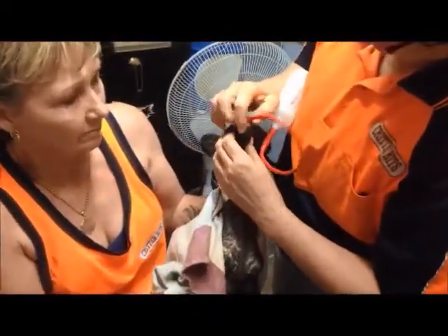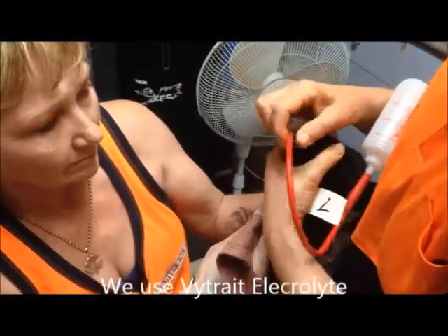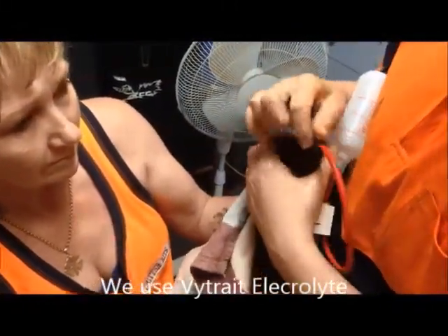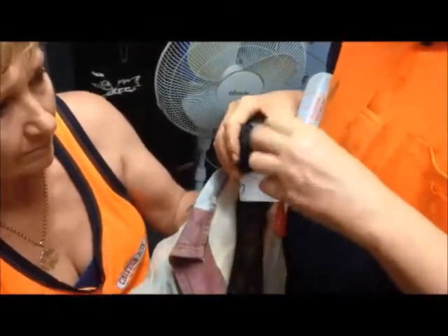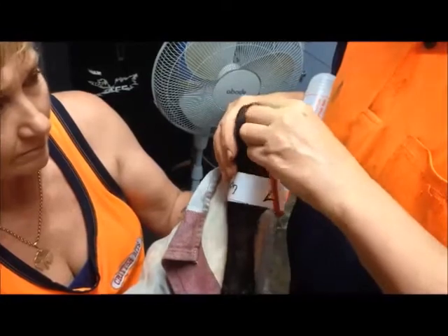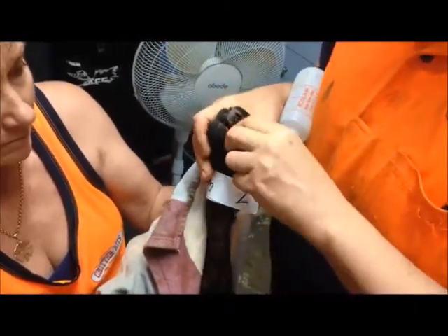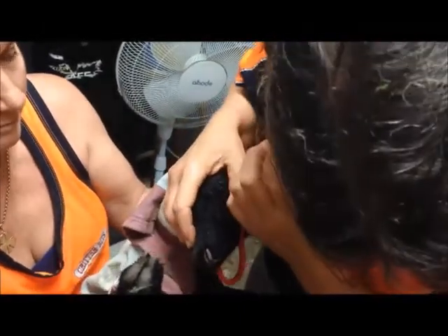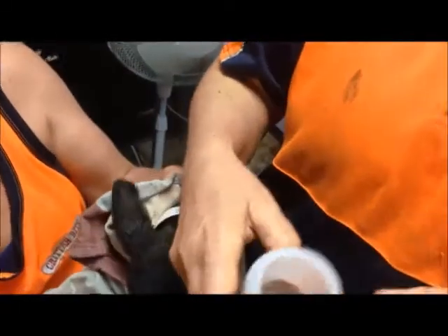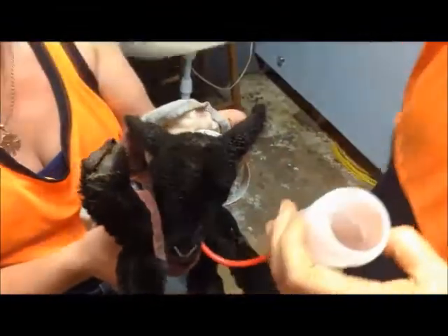You pop it down his little throat — they don't like this terribly much, but it sure as hell saves their lives. You've got to get this in as far as you can. You can see his little throat swallowing — he's swallowing the tube down. It's very hard to get it in the airway. You can see how much of the tube you've put down, and you can just have a little listen — put the phone there. You can hear it sort of gurgling, so we know it's in his stomach.